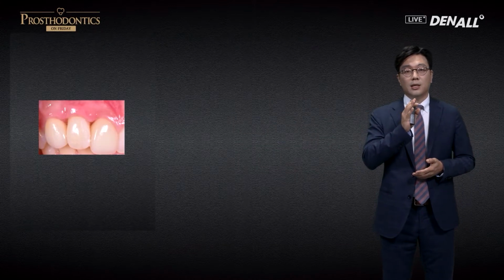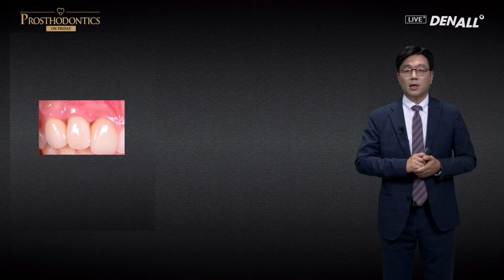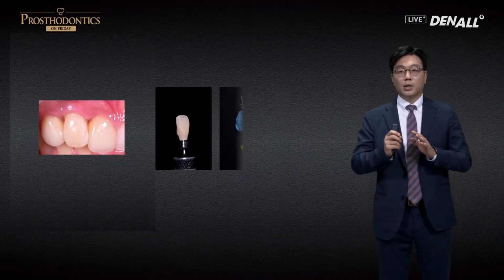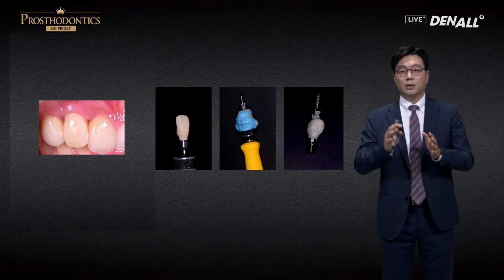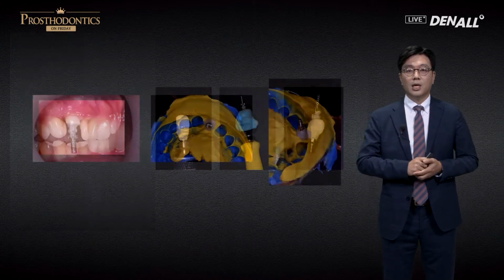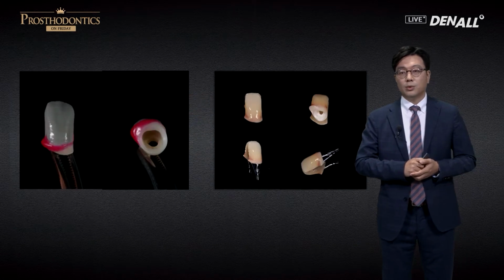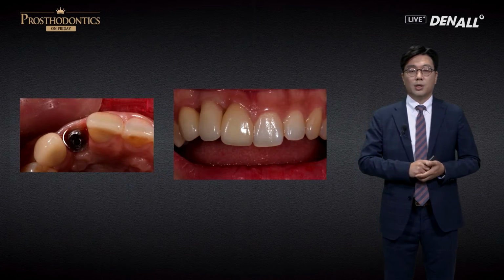Between the gingiva, the papilla is receded, and we made the adjustment. It is a core, so it's not filled up. I used a temporary. In the mesial side, the contour is made, over contouring. An impression is taken. The final prosthesis is fabricated, and it is delivered.